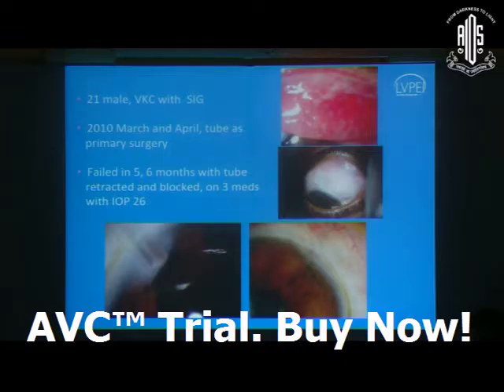So this was one patient who was operated on. We had bilateral tubes done, had a very short tube and the bevel was down and both the tubes were blocked, ended up having very high pressures in the immediate, I think 5 to 6 months post-operative period. So I tried seeing if I can try and revise this.